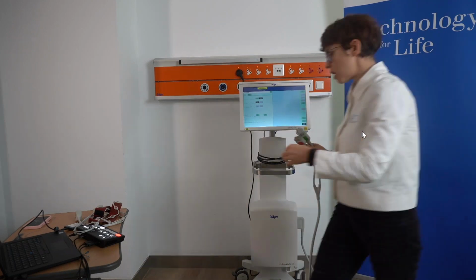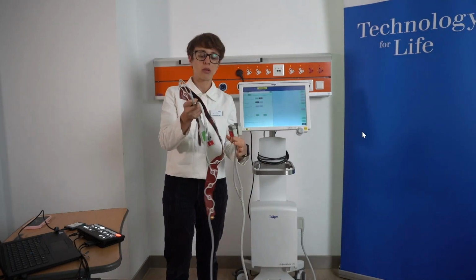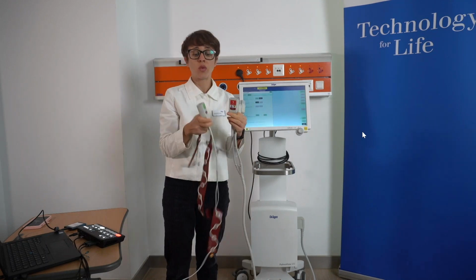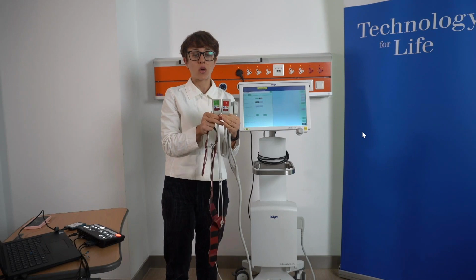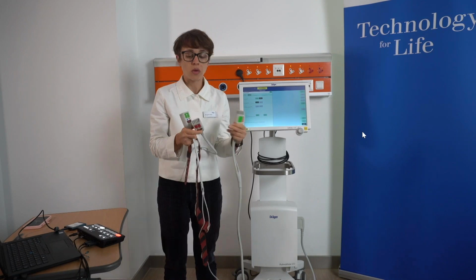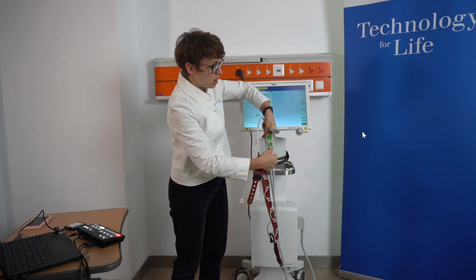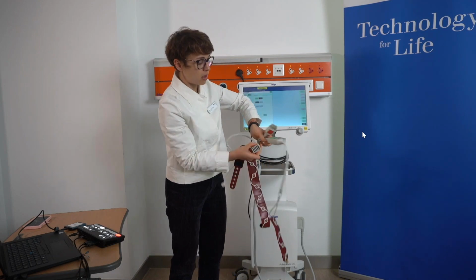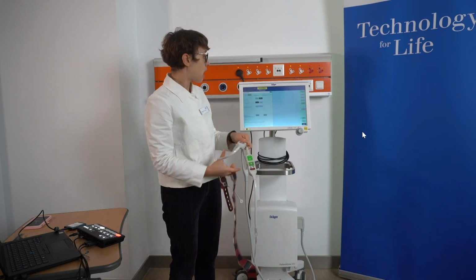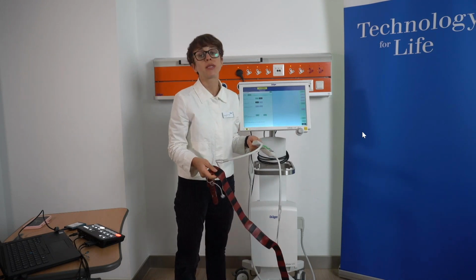If we now look at the patient belt, we will see that it also has two extensions that are color-coded with green and red, the R and the red. In order to perform the measurements, we would need to connect the green to green, and the red to red. Now we would be able to start the measurement.